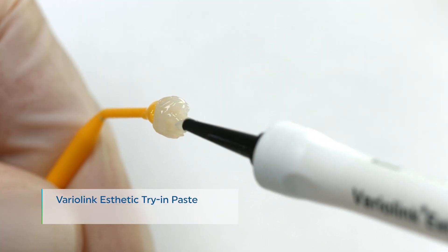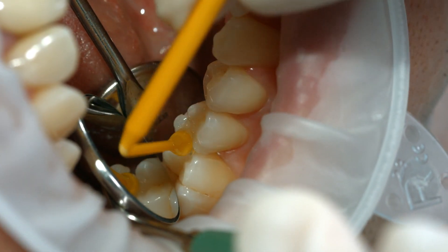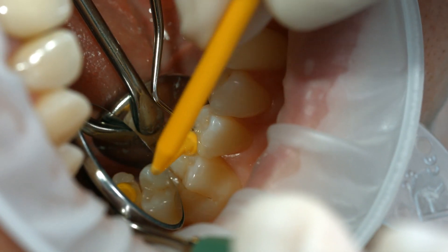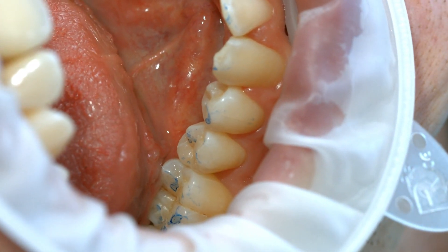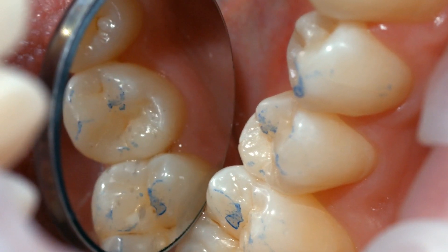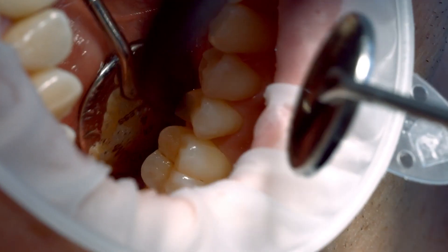For optimum aesthetic results, use Variolink Aesthetic Try-In Paste to evaluate the shade of the restoration. When trying in the permanent restoration, check the shade effect, accuracy of fit, and occlusion of the restoration. Thoroughly rinse off the try-in paste with water spray after the try-in and dry the preparation with water and oil-free air.